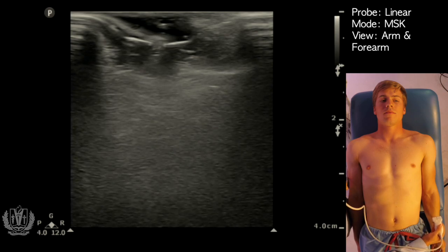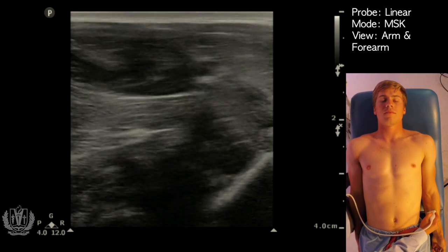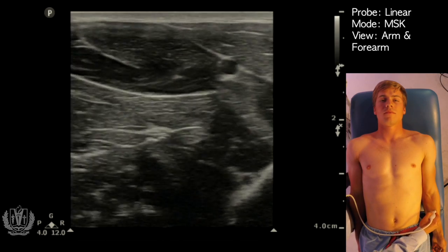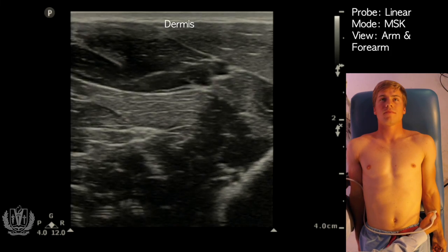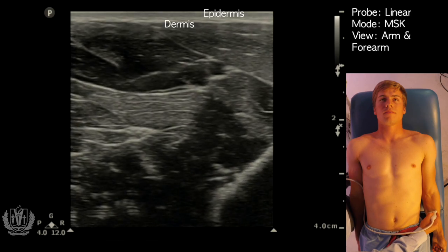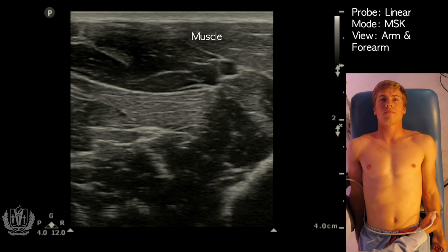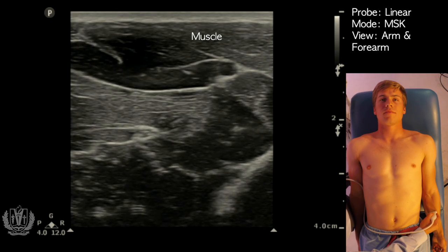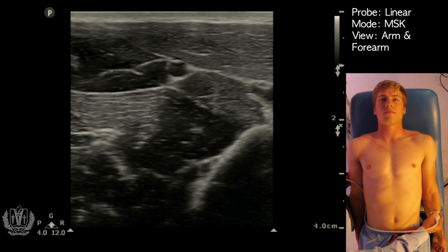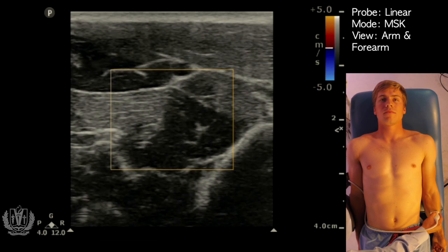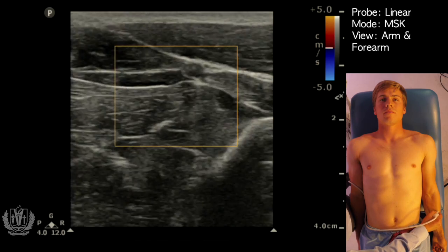I'm going to look at his mid forearm right here and identify some structures. Going from top to bottom, the very top layer is going to be your dermis and epidermis, and just posterior to that you see muscle and some fascial layers. In the middle you can see a little pulsating structure that's actually an artery, which you can confirm with color flow Doppler.